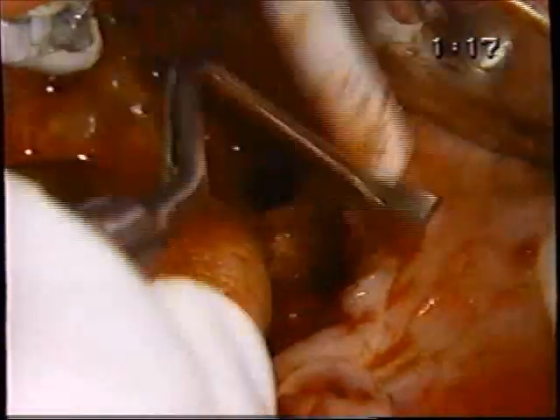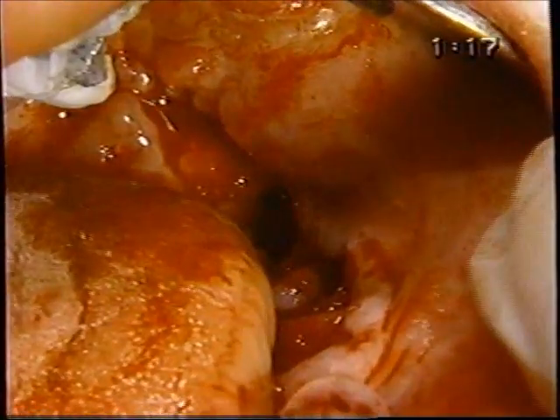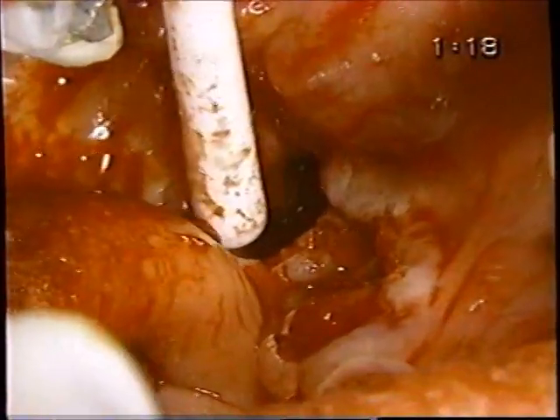Let's work on the infection for just a minute. Now there's some there that's coming towards the suction. And the quickest way to get that out is with a needle holder. You pull it forward with the suction, and I'll grab it at the base. Okay, just hold it up in the air. Okay, there we go.